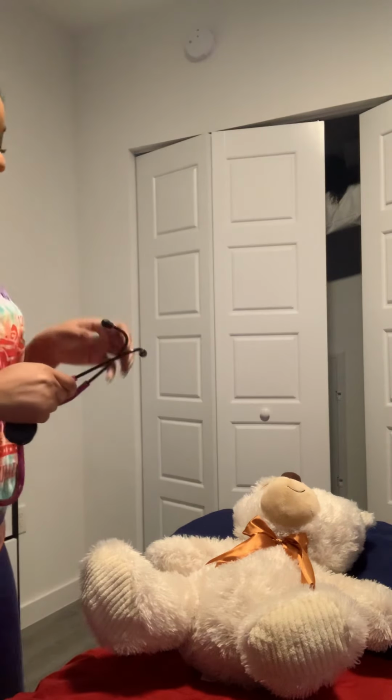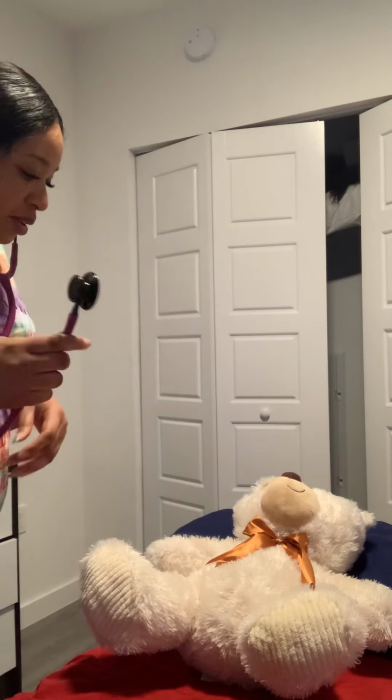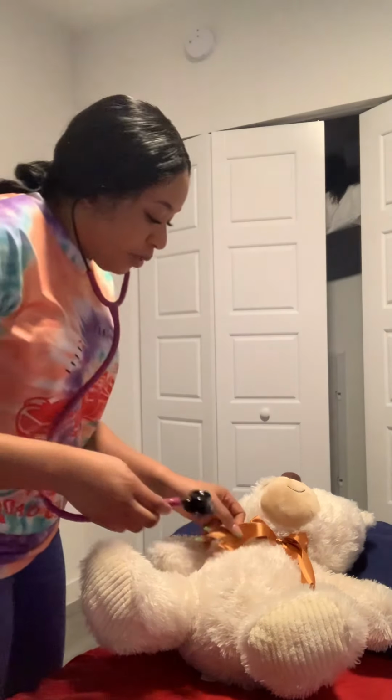Okay, so I'm going to use my stethoscope to auscultate the patient's heart sounds and make sure there are no murmurs or abnormal sounds. It's just going to be the regular lub-dub, S1, S2 sounds.